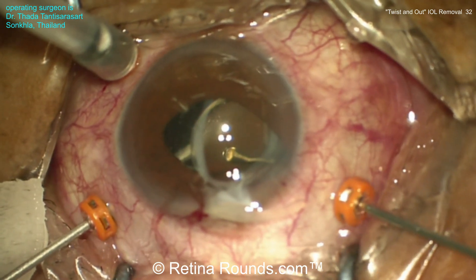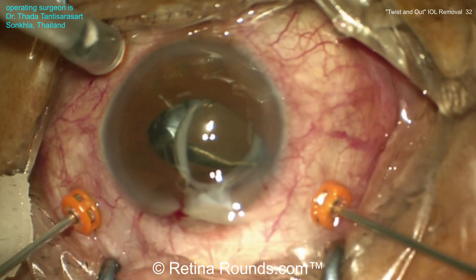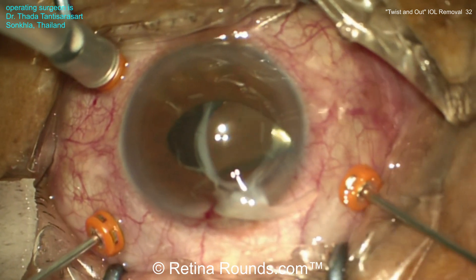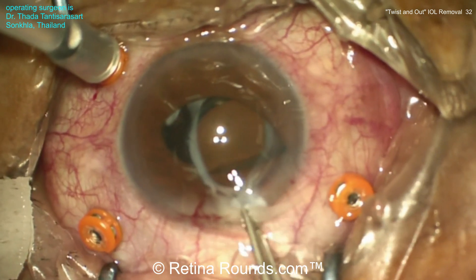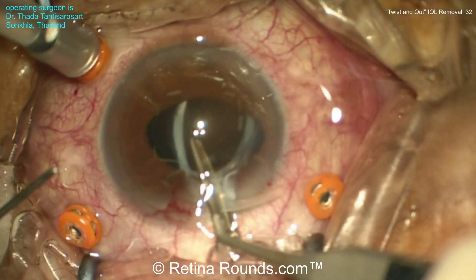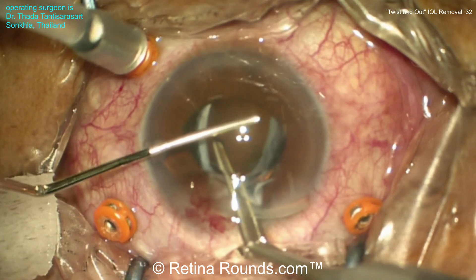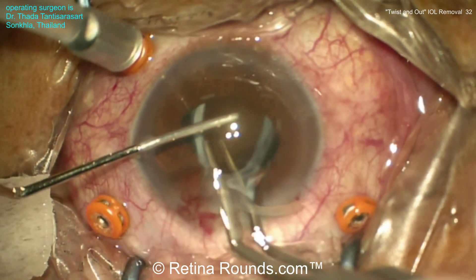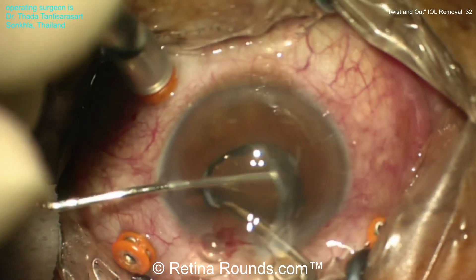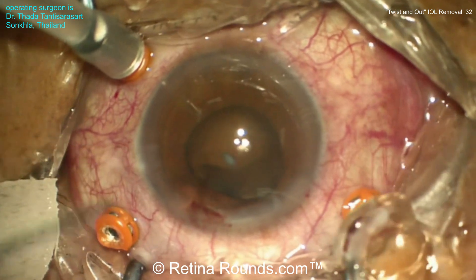It's important to perform at least an anterior vitrectomy at this stage to ensure that any vitreous entangled in the lens doesn't prolapse through the corneal wound as the lens is being removed. That's going to help decrease any traction on the retina and the vitreous base in particular, decreasing the risk for a peripheral retinal break. Using a McPherson forceps — and it's important to use a small dimension forceps because that takes up some space in the corneal wound — the lens is held, and then a spatula is used to protect the endothelium. That's not only going to protect the endothelium, but also serve as the surface upon which the lens is folded. The forcep is then turned, and the lens is folded in half and externalized through that clear corneal wound.